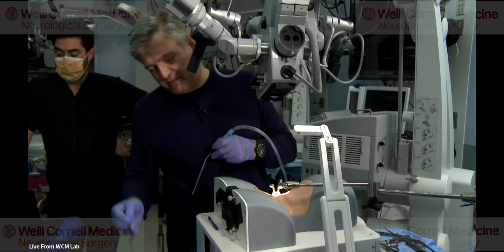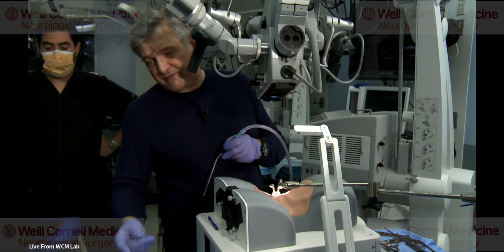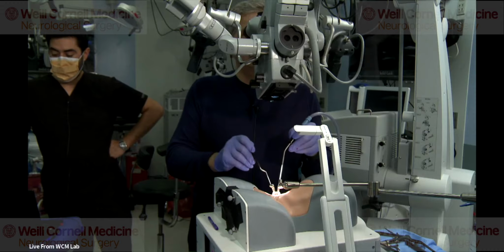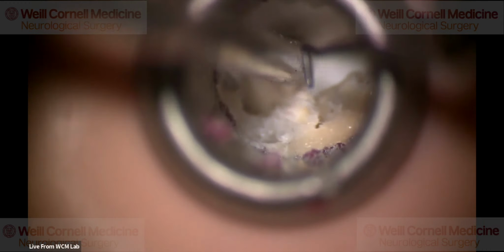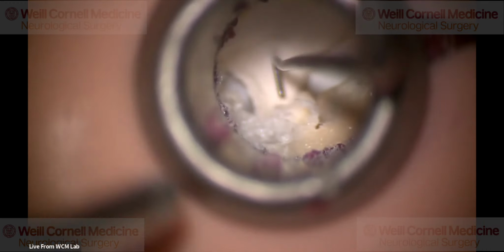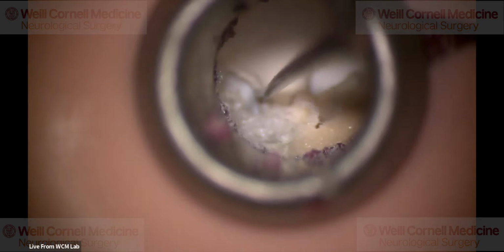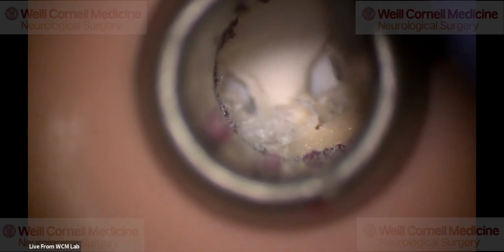So I use the ball tip here to feel, but I also have bayoneted Rosen instruments that are nice in patients who have severe foraminal stenosis. Because if somebody has severe foraminal stenosis, you don't want to put the ball tip in there because it's pretty big, and the same with the curette. So bayoneted Rosen instruments are certainly available, and you can use those to feel for the nerve root here.